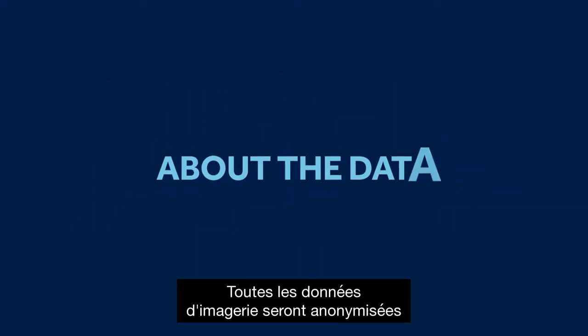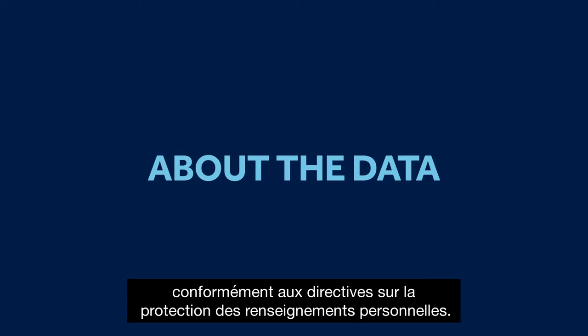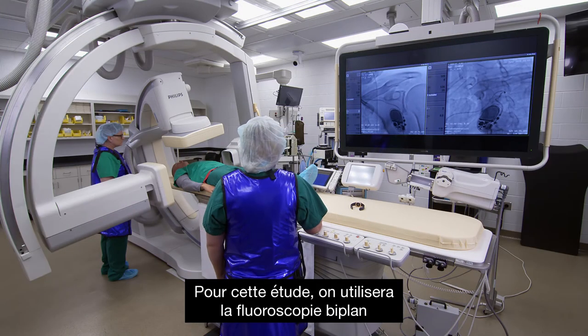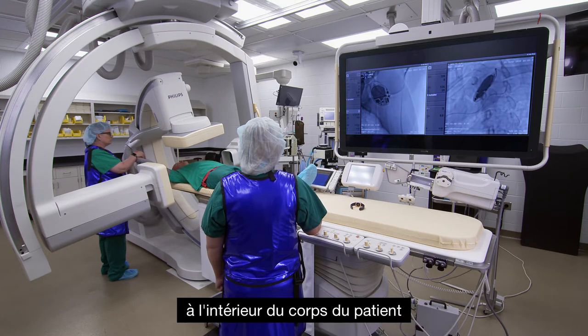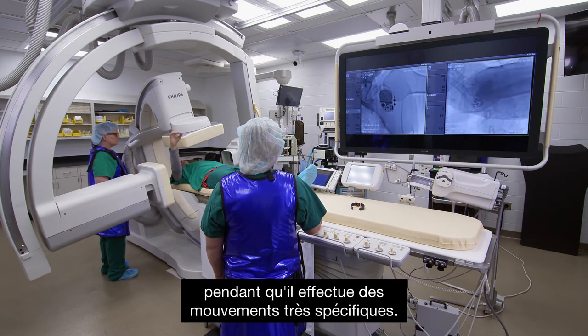All of the imaging data will be anonymized per HIPAA guidelines. For this study, we'll be using biplane fluoroscopy to capture the movement of the lead inside the patient's body as they do very specific movements.